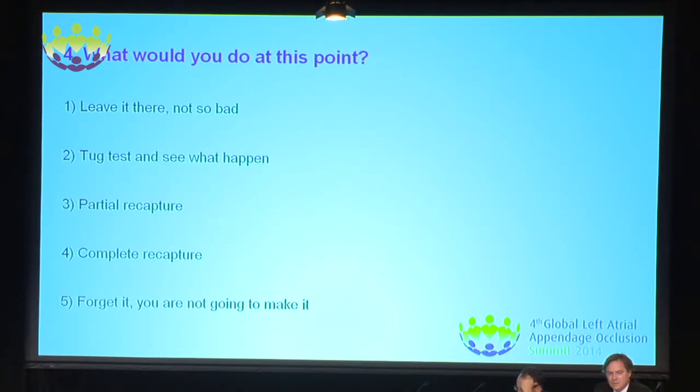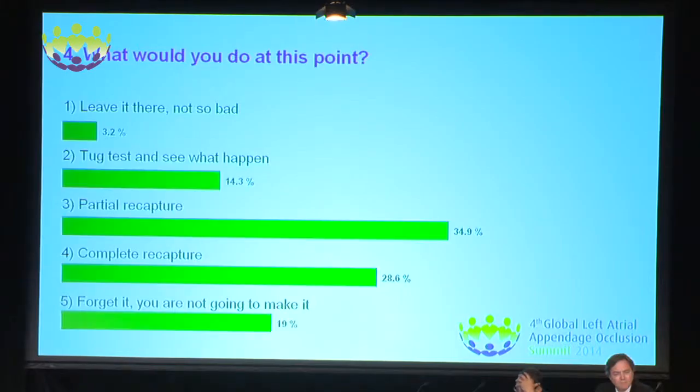Leave it there, it's not so bad, tug test and see what happens. Partial recapture, complete recapture, or forget it, you are not going to make it. So most of you recommend to do partial recapture. At this point, we decided not to do any recapture, not partial, not complete.